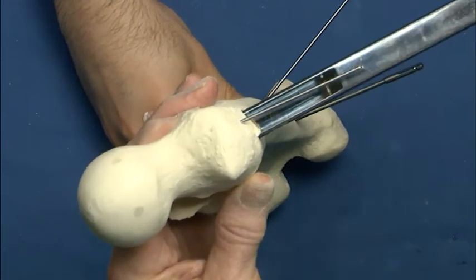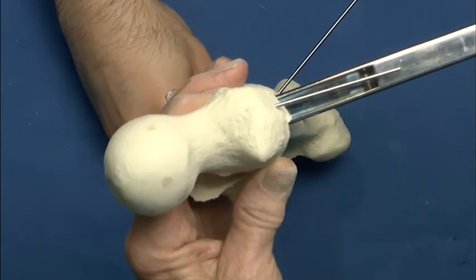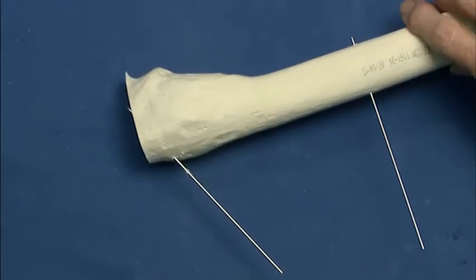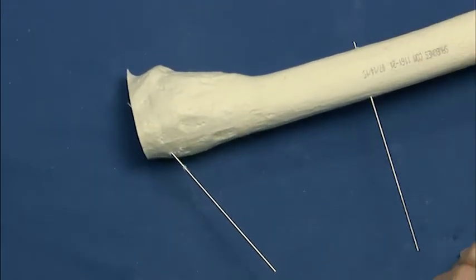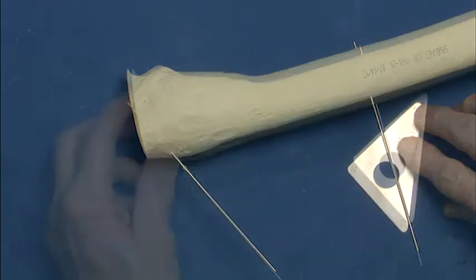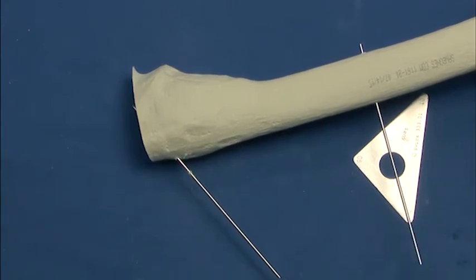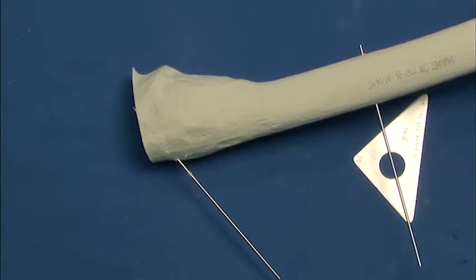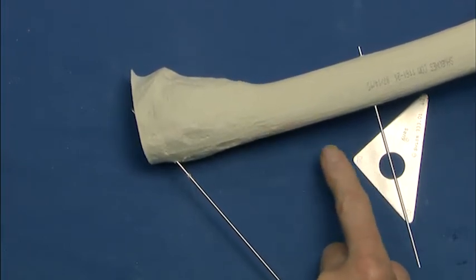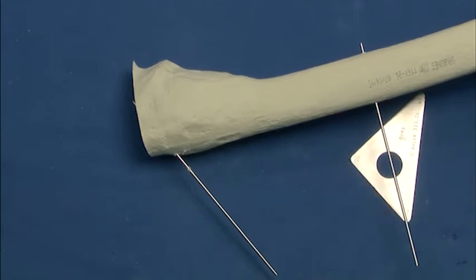So now we've completely compensated for the torsional problem. We'll end up with 15 degrees of anteversion. We now have a reference for the closing wedge, which is done after the derotation, and we're going to bisect the 50-degree angle. And hopefully these wires are going to be parallel, so this will be our 25-degree closing wedge. Okay. You can move this reference up if it's easier to here, and I suggest you do that the first few times you actually measure these corrections.